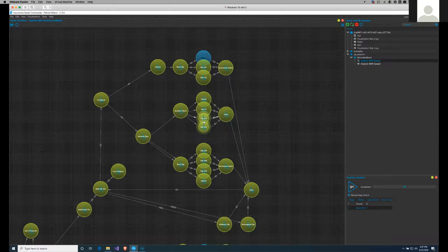So what we've seen a lot is that in traditional setups, there is a neurofeedback practitioner. He or she hooks up his client and then sits right next to the client and gives advice and some recommendation or some rewards just personally, like in person.